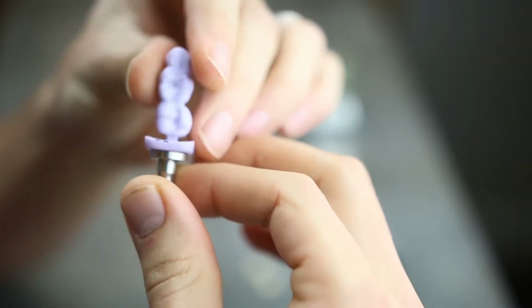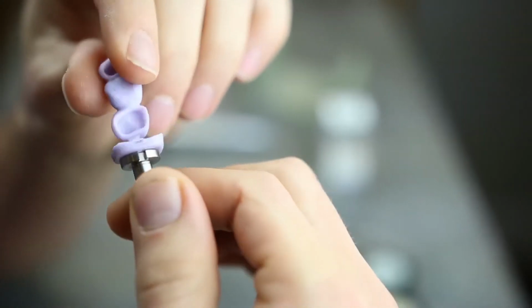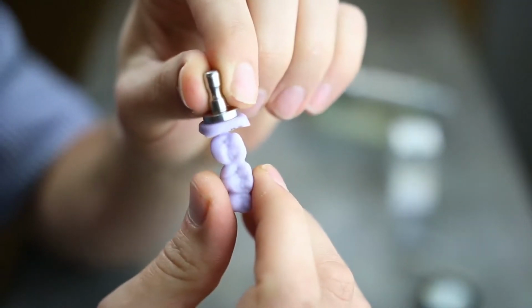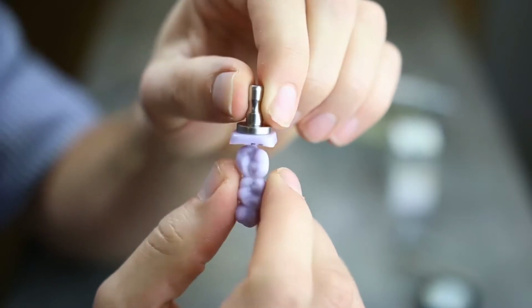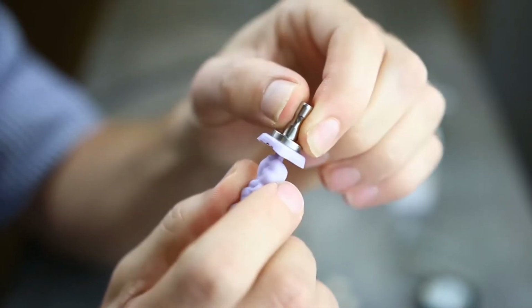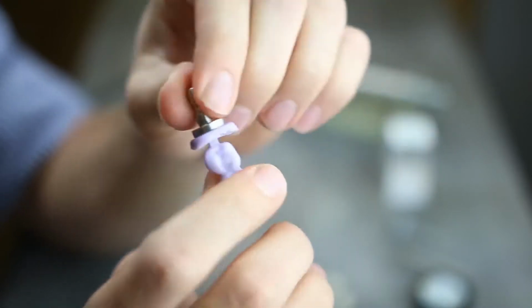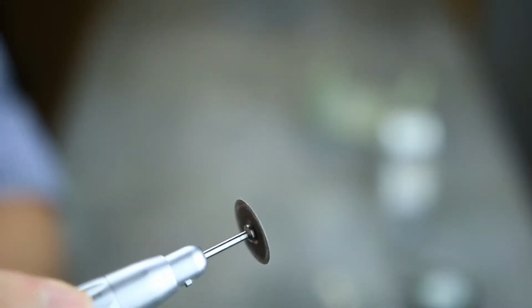With this Emax bridge case, it comes out of the mill and unfortunately the anatomy is not that great. So we want to try and increase the quality of our restoration by adding some post-mill refinement and then finishing with a nice high shine. And ideally, we don't want to do that with too much time.